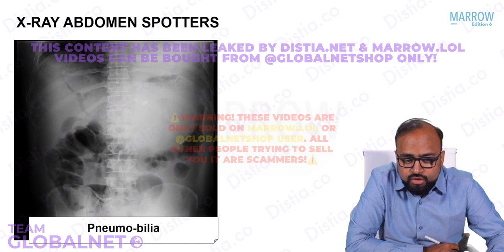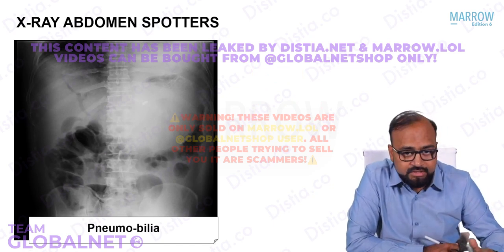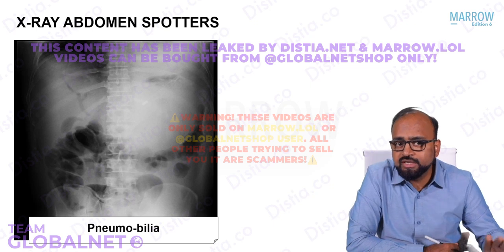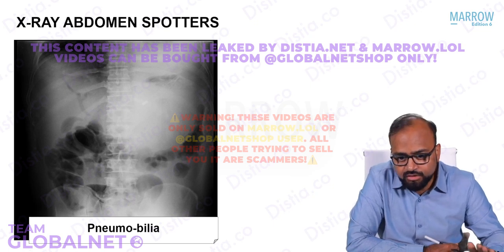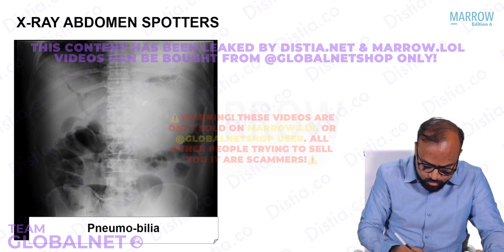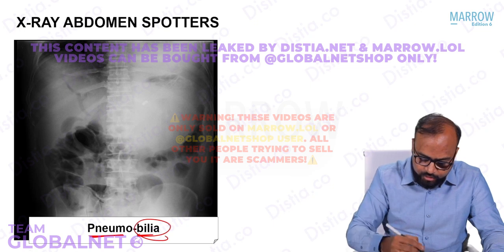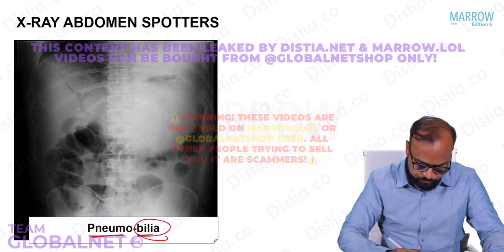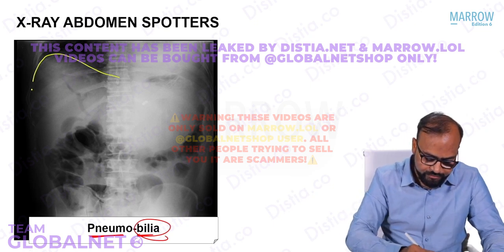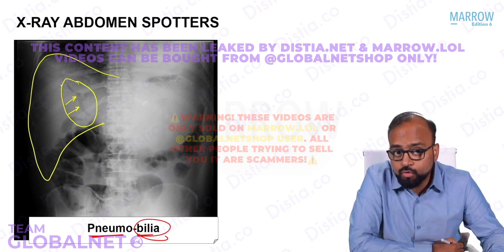Now let us consider pneumobilia. Actually, I could have considered it in the hepatobiliary discussion, but I am discussing it here because it is related to a condition that causes intestinal obstruction. So what is pneumobilia? As the name suggests, pneumobilia is air within the biliary tree. How will it look? Look at this particular radiograph. On this radiograph, this is how the liver is going to be. Inside the liver, can you see this black line? Where is it located? It is located in the central portion, close to the porta hepatis.